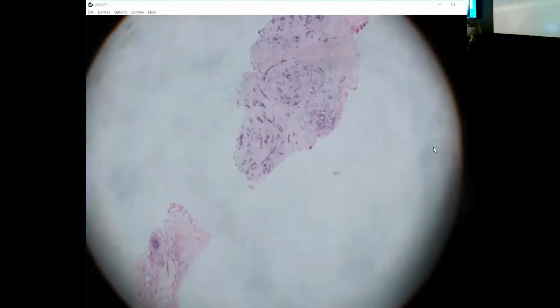All right. So I think this is sort of a tricky case too. Let's see if I want to show you. I'm going to close this for a second because I want to get to the bit that's the trickiest bit. All right. Okay. So, oh dear, did I break it?